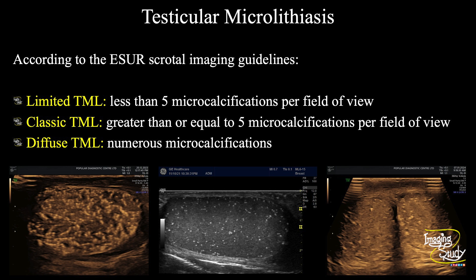We have three different types of testicular microlithiasis depending on the number per field of view. If you see less than 5 per field of view, it is called limited testicular microlithiasis. If it is around 5 to 10, it is called the classic type. And if it is more than 10, we call it diffuse testicular microlithiasis.